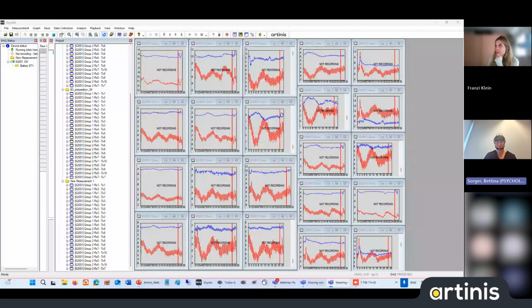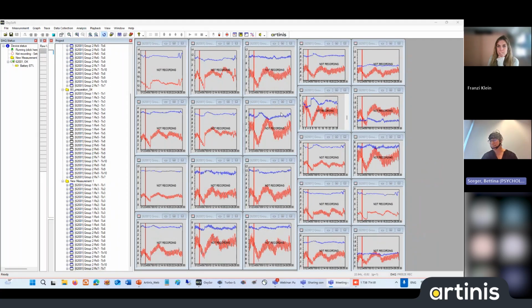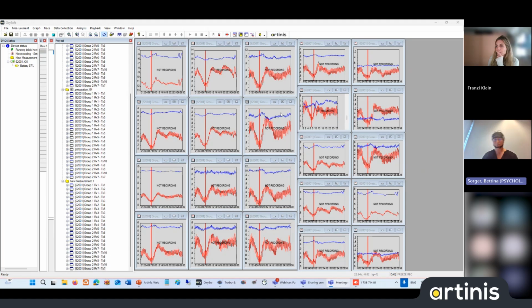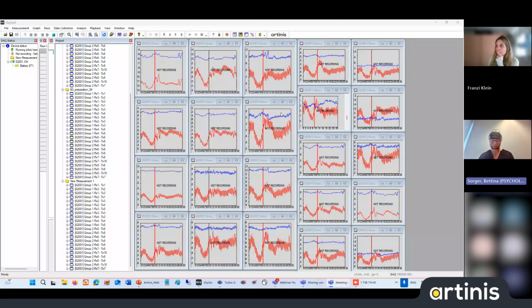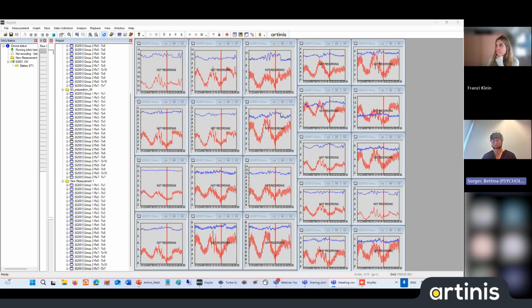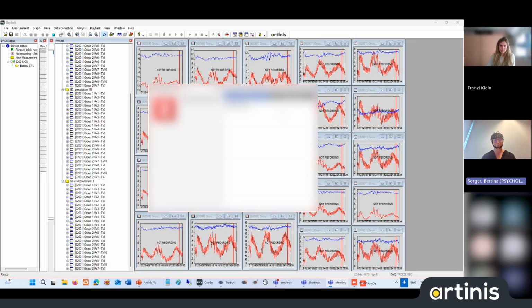Yeah, great. I mean, you look now at the OxySoft software, and before we start, I would like to demonstrate the nice motion robustness that we have with the system. So when I move my head in different direction, you see there is not a big change. We see the normal Meyer waves that we always see, but you really see that what Franzi also explained, the pulse information. So we should have a good signal quality in almost all channels.